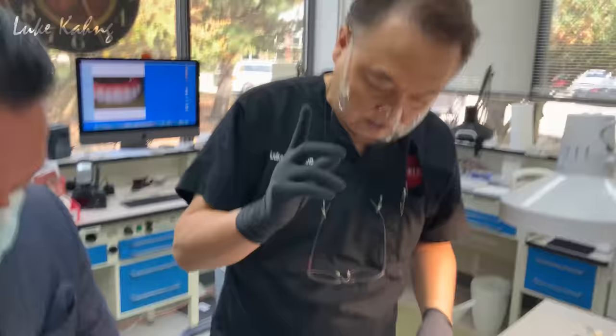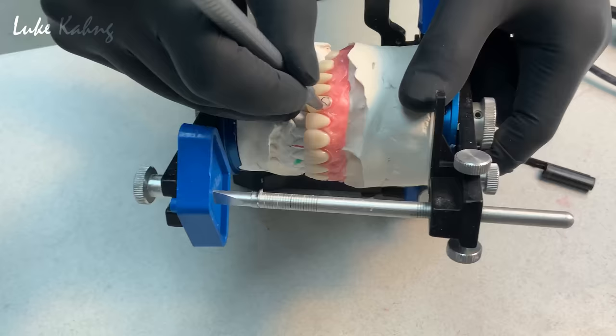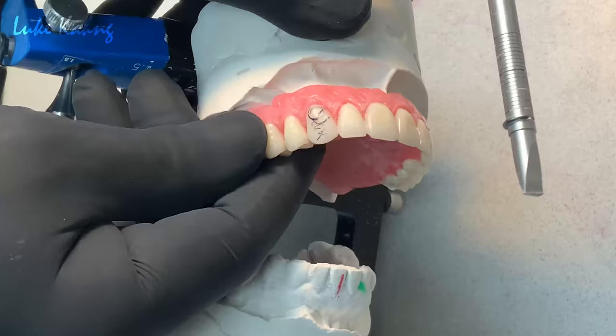So, what the patient said, and this little part is sticking out, right? Yes. Probably here too. Yep. So here a little bit. A little bit. Yeah, but you're right. So, I can grind it because of the... There's no room. No room. So, we're going to show you how I grind it from here.